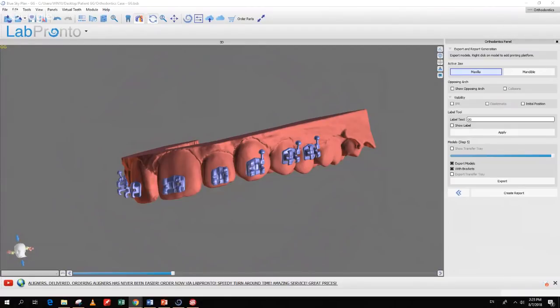Okay, that's the upper or the lower. It doesn't matter how many models or how many aligners you're exporting from the case. It's still half of an export. And we intentionally kept the price quite low because we understand that a fair amount of cases have to be modified during the patient's treatment, and new models have to be taken and imported into the software, and the plan has to be updated. So it's half of an export per jaw, and if you need to redo the case, then the fee goes up to just one export per jaw. And if you don't need to redo the case, then it stays at half of the export. So we intentionally kept the price quite reasonable.